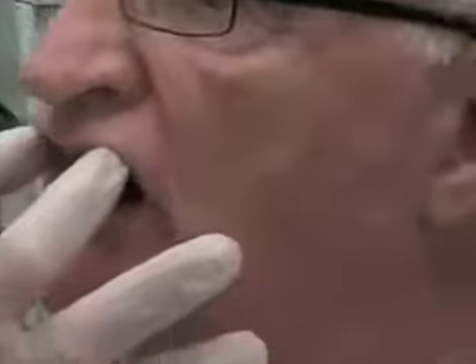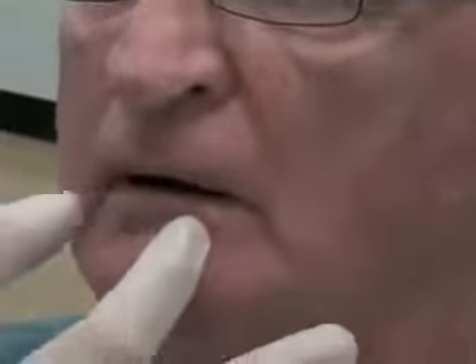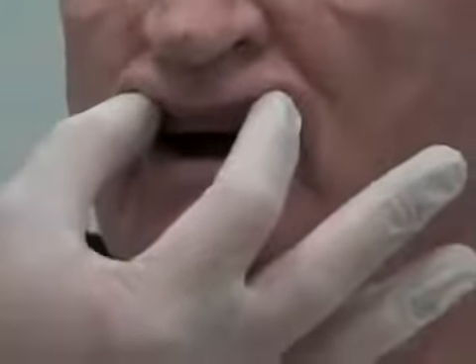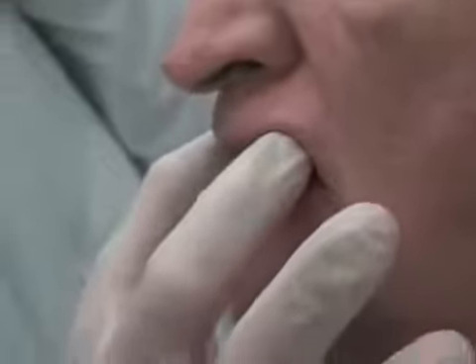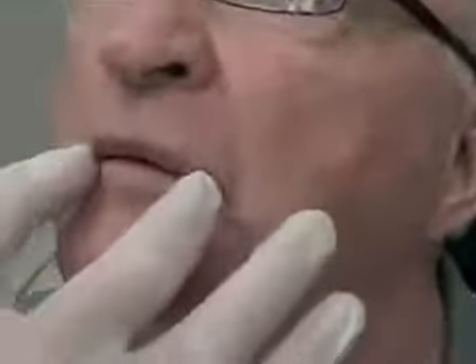When you have the vertical dimension and the lip support correct, the incisal edge of the rim should just be below the incisal edge, and the nasolabial angle should be about 90 degrees. When you use your fingers on the lip, it shouldn't feel strained or collapsed. This maxillary rim is adjusted so it's just about at the perfect spot. Notice the edge of the rim just showing below that lip at rest.